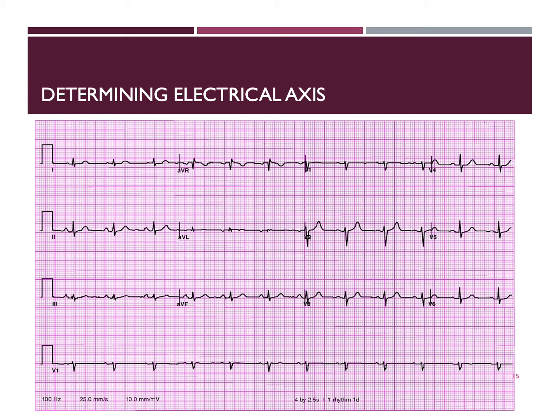What we're looking for is the most equiphasic or isoelectric QRS complexes in these leads. Lead aVL shows QRS complexes that most closely reflect our criteria. So once again, lead aVL is what's showing us those QRS complexes that reflect the criteria we're looking for. So the patient's QRS axis is perpendicular to the positive electrode in lead aVL.